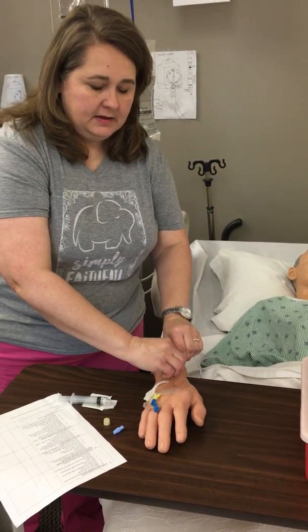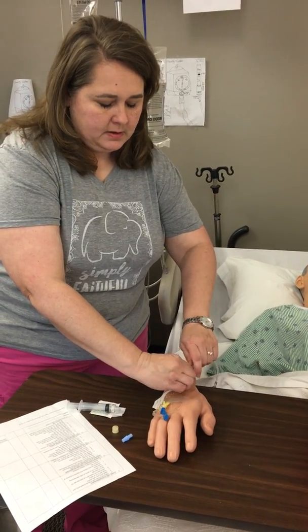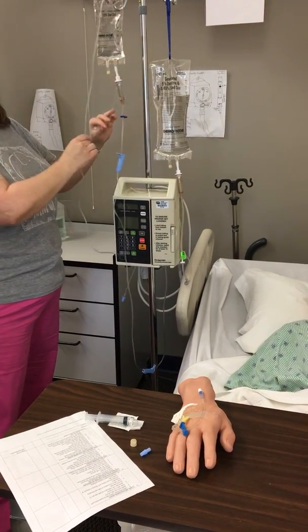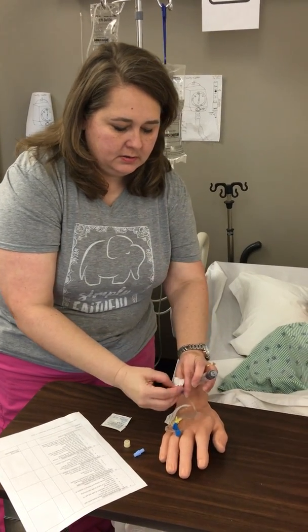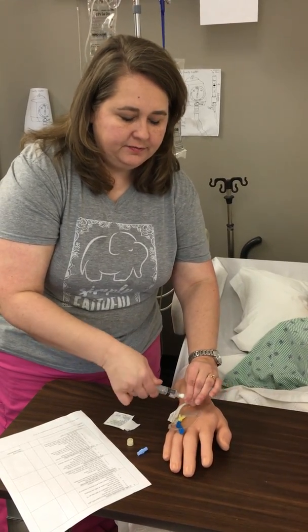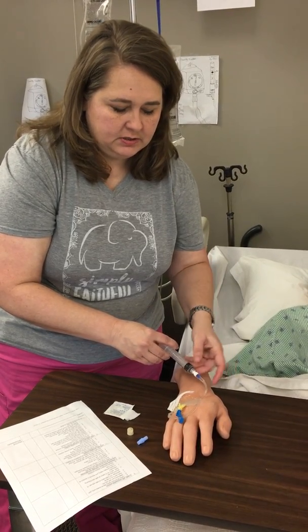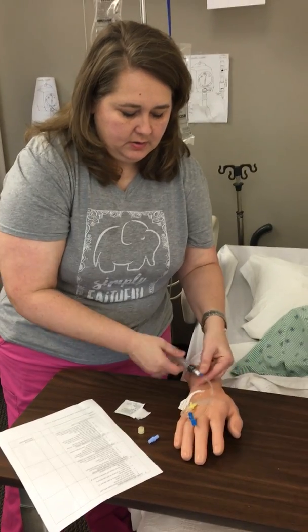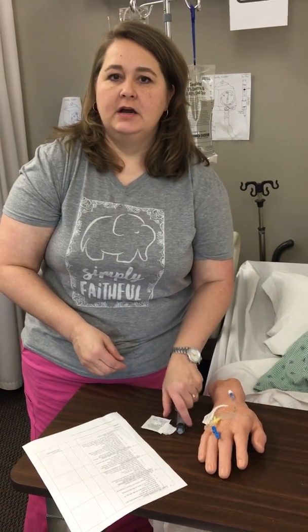I'm going to disconnect my primary tubing, because when you infuse IV piggyback through an INT, you set it up just like a primary. So I no longer need this. I'm going to swab my port with a clean alcohol, uncap my flush, and flush this INT using a slow, steady push for the saline flush. At the end, I want to be sure to reclamp my INT extension set. Remove my flush, discard my syringe in the sharps container, wash my hands, and document appropriately.